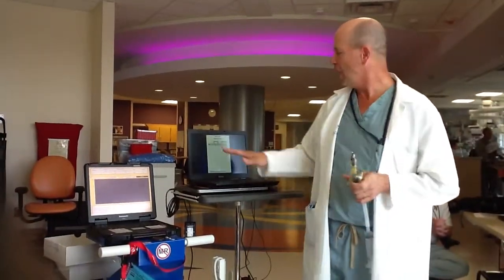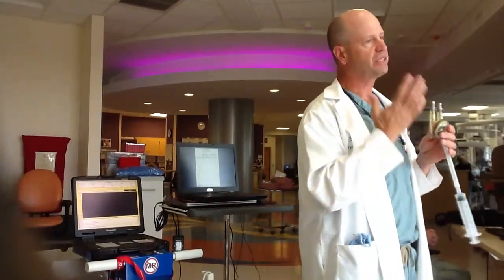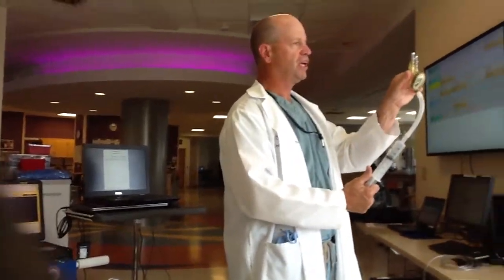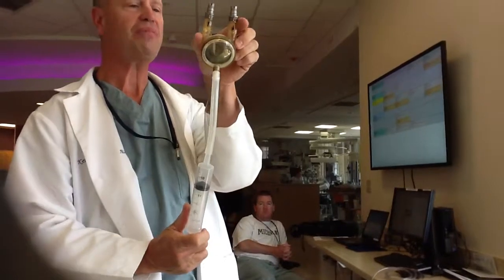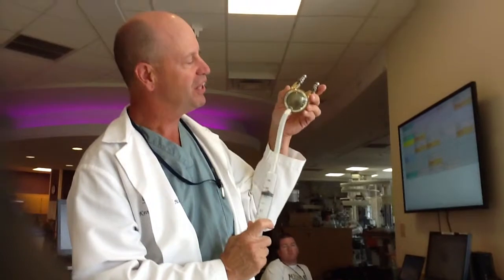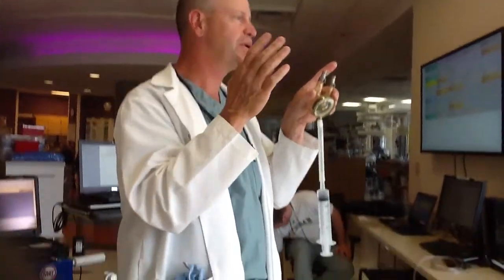The other part is: is the pump completely filling and emptying? Here's the subjective part. If it's filling all the way, we call that plus-plus. If it's filling all the way except for a little dimple, we would call that plus-minus. And if it's not filling well at all — like a big dimple — then we would call that minus-minus.